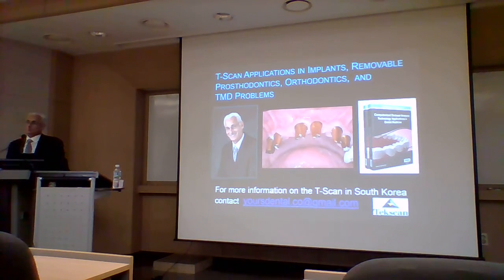So the T-scan is the most relevant digital tool you have because it's going to be used many times during a day. You might scan an arch full of implants once every 3 or 4 months if you're lucky, if you're busy that way in your practice. But you'll put in a lot of single crowns and a lot of 2 crowns and a lot of 3 crowns next to each other, and that's where the occlusal problems start. You heard it from my patient. She had some crowns and inlays done and threw her bite off. Happens all the time. So no one is trying to compete with the T-scan because it's too difficult to break into the marketplace.